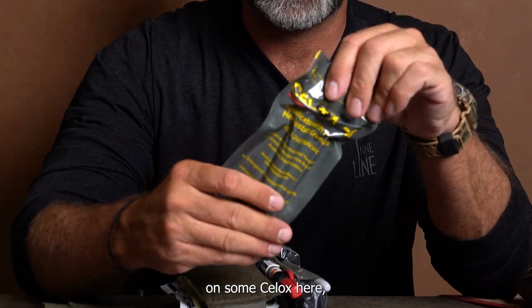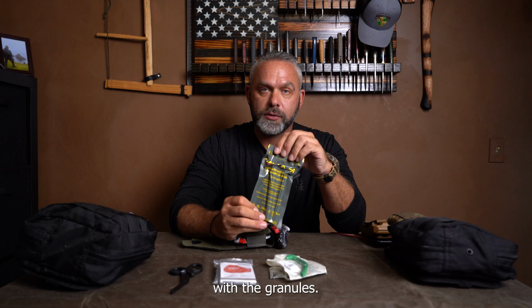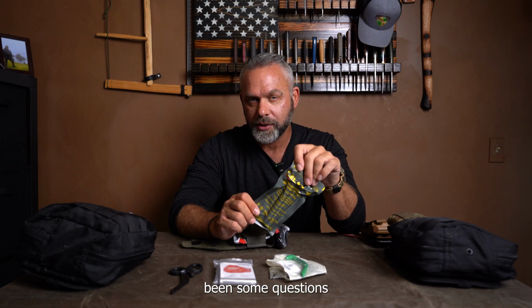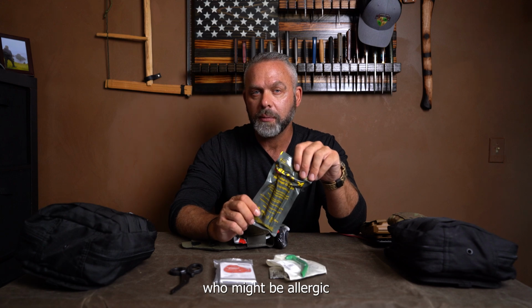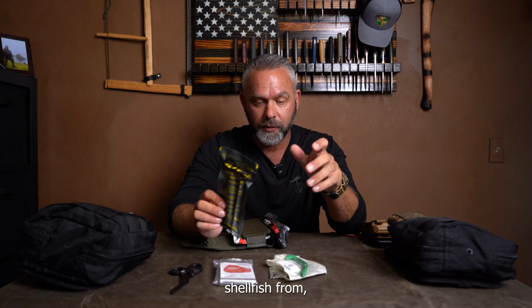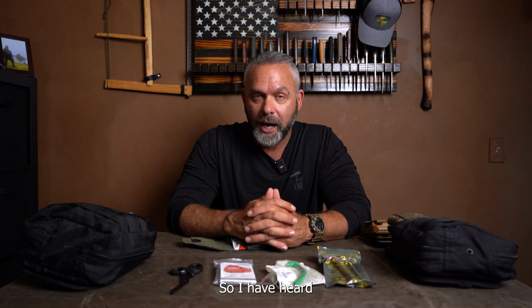Now I throw in some Celox here. This is basically a syringe that's filled with the granules, the hemostatic granules. There have been some questions and talk about people who might be allergic to shellfish. I am one of those people. I am very highly allergic to shrimp, crab, lobster, all the tasty stuff. Celox is derived from a part of a shellfish from my understanding and from a little bit of research that I've done. So I have heard from some professionals, they say, don't risk it.